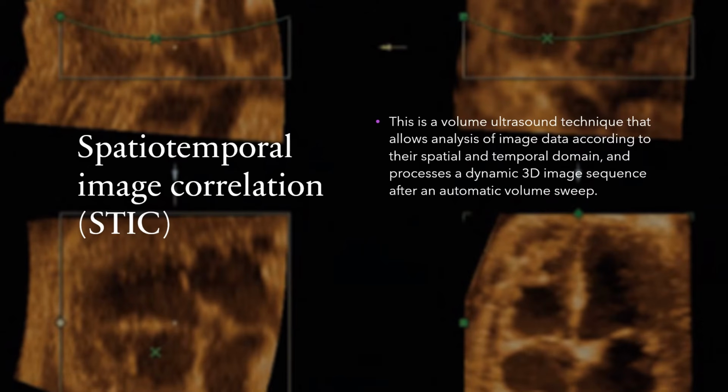STIC begins by performing an automatic volume sweep. This sweep captures a dynamic sequence of 3D images, which is then processed to create a time-synchronized 3D reconstruction. The resulting sequence allows for the visualization of dynamic structures such as the fetal heart in various stages of the cardiac cycle.